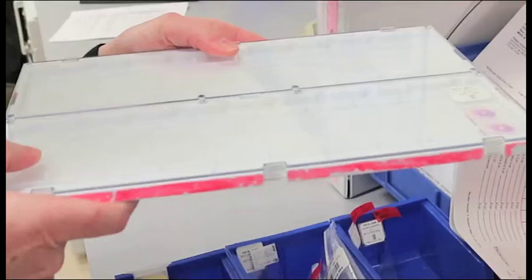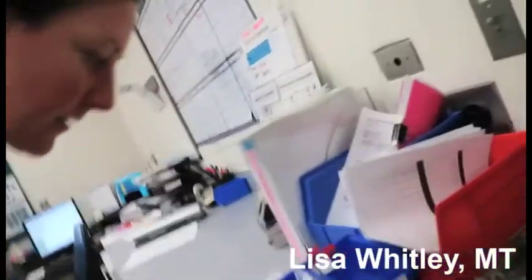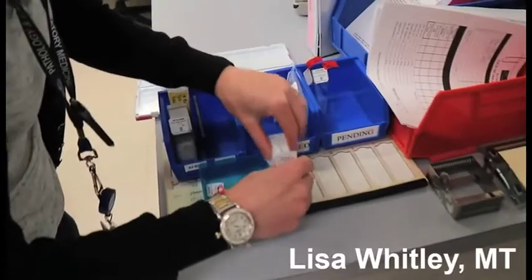The image here shows a slide tray, white in color, which has a pink border. And please don't be surprised, but this pink border is actually a technologist's idea, who came up with a way to distinguish molecular slide review trays from the other slide trays on the pathologist box by applying nail polish on their side. For molecular reviews, a pathologist has to look at a slide.